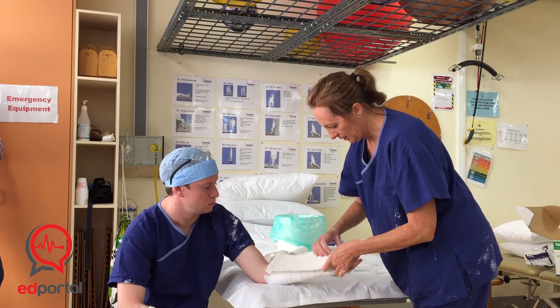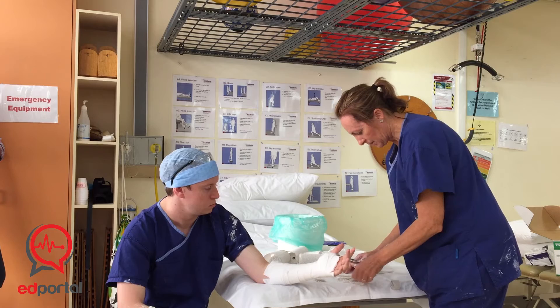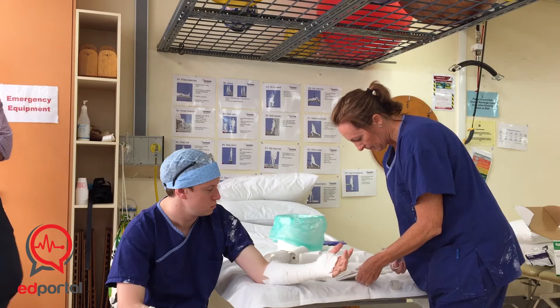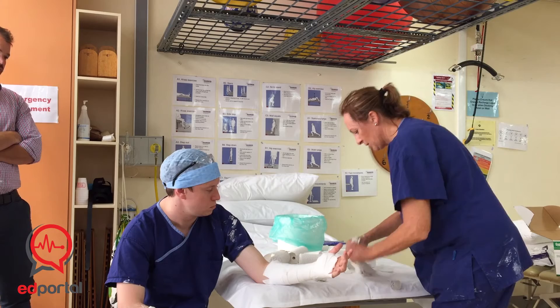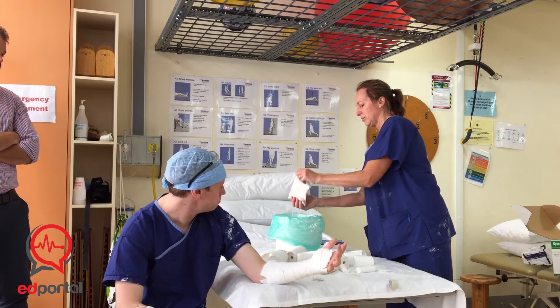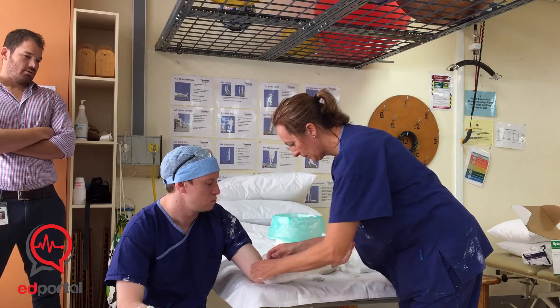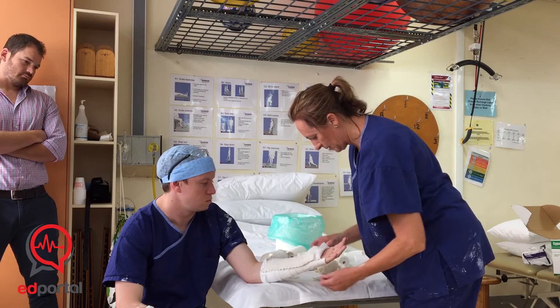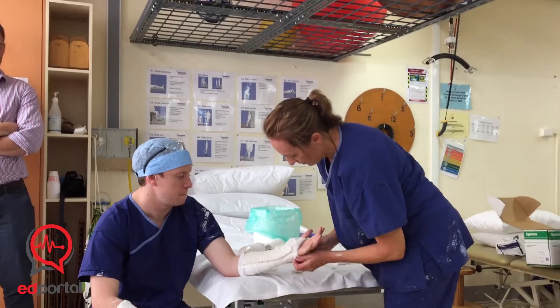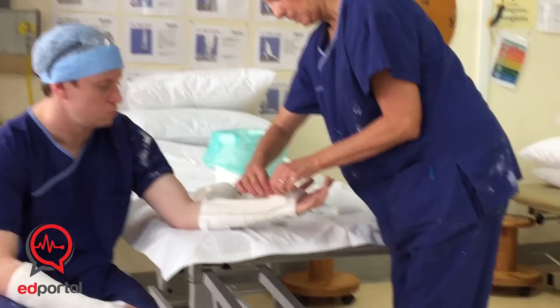Just a little bit to go. You can either fold that back when it's wet or you can cut the half circle out — it looks a bit less bulky if you do that. There are a fair few layers there; one roll is probably at least ten layers. Dip it in a bucket, and once you've wet it, just sling it down a bit and apply it on. You can also make ridges in it — that just gives it a third dimension and a bit more strength.